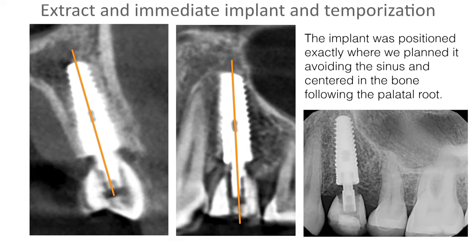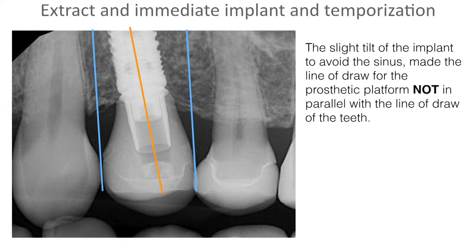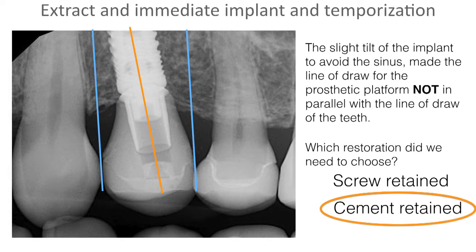It was positioned perfectly where we wanted it, but what it left us restoratively was slightly off angled. So obviously, this left me with a cement retained. But if you notice in the cement retained here, how high I was able to put the margin of the abutment was really high there, because I didn't have to. I can do wherever the contour of the tissue was. So which do we use? Again, we use cement retained in this case.